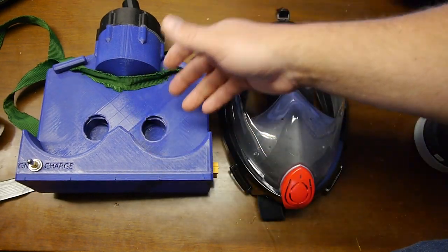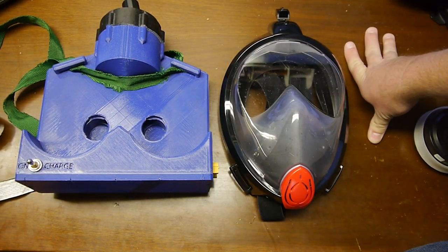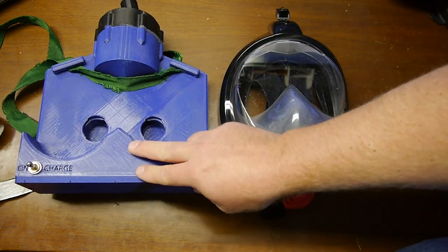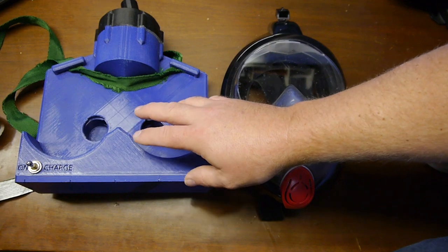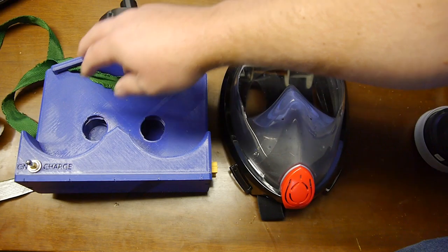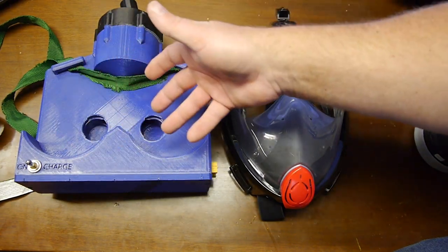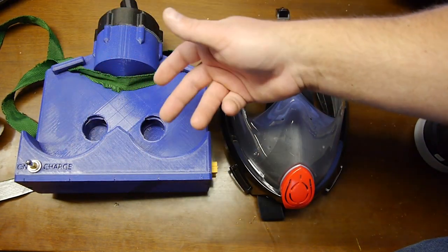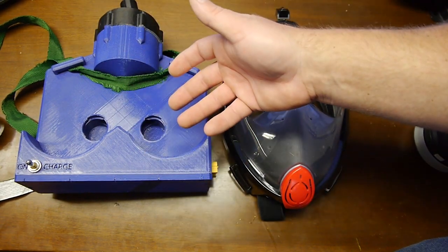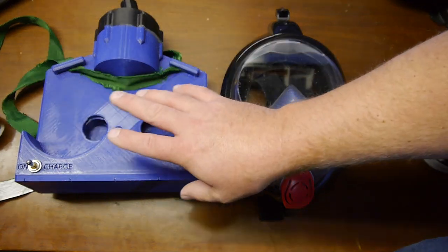Some people have expressed interest in making this to help people during this pandemic, which I think is spectacular. I'm all for it. I just don't think this is ideal. It's too complicated. It takes too long to print. If it was a one-off and you had all of this equipment, like the motor, the Arduino, the batteries, and the charger for the batteries, and then there's the life cycle, right? Because this will maybe blow for a couple hours. Maybe you need it for longer, and then what? So I've scrapped this idea completely.